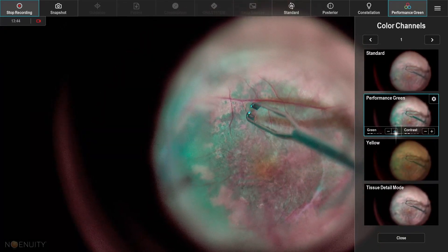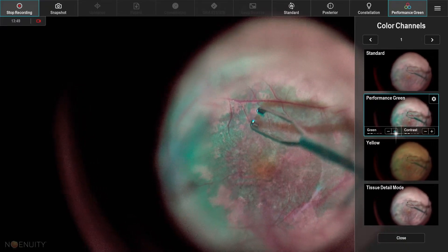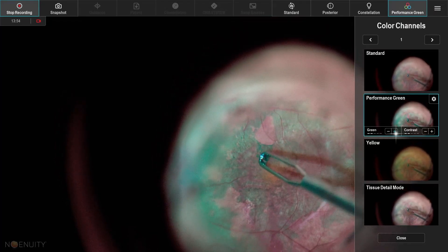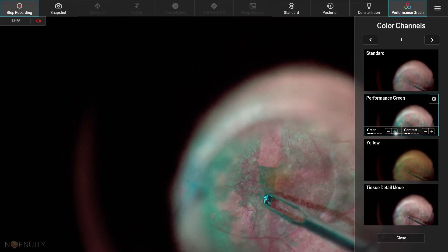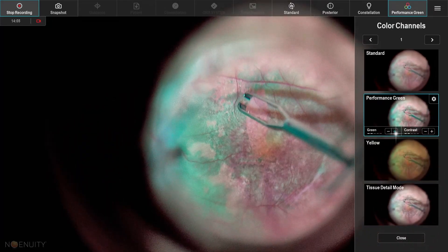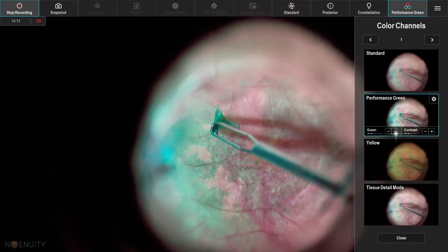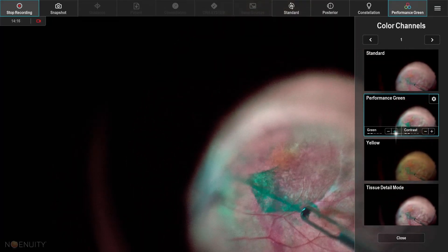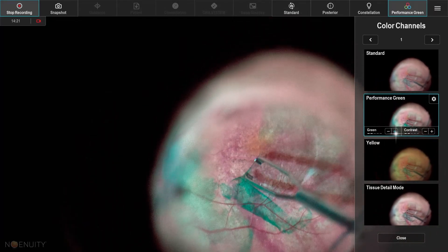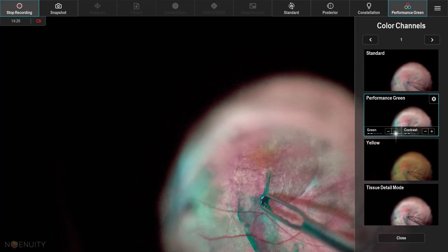I like to take whatever the ILM is going to give me — it's a pinch-and-peel technique with these 44 forceps. This is also with that green enhancement mode I just love so much, courtesy of the Ingenuity. When I say I take what I can, basically if the ILM starts to go a certain direction as I'm peeling it, I just go with it. I use that first strip that I peeled as kind of a fulcrum, and the center point of that first strip is the fovea, so I can just sort of peel around the fovea. This is real time — I try not to edit this part because I do think it's valuable to see how we do our pinch and peel.